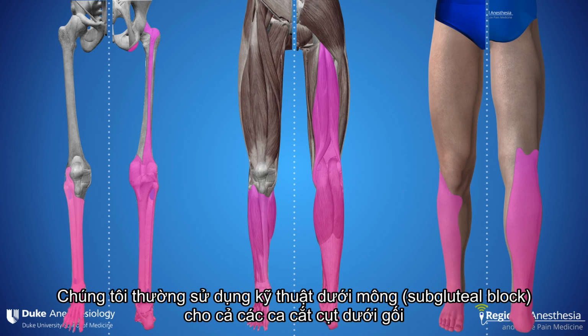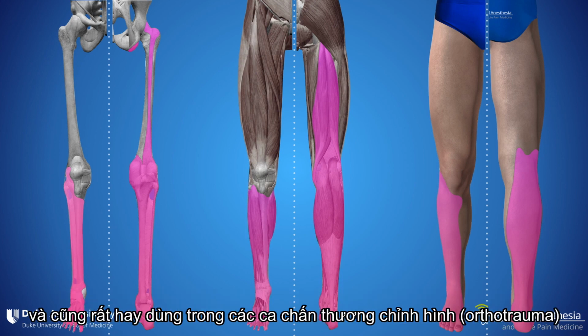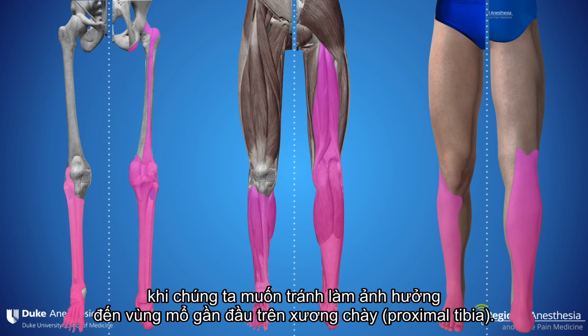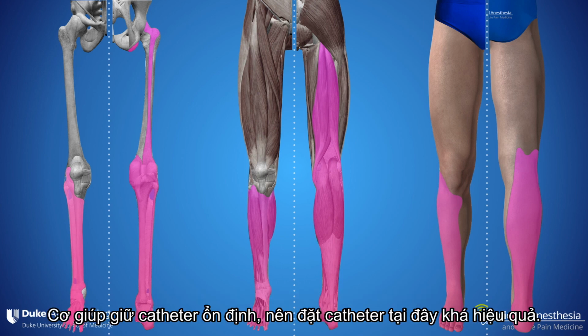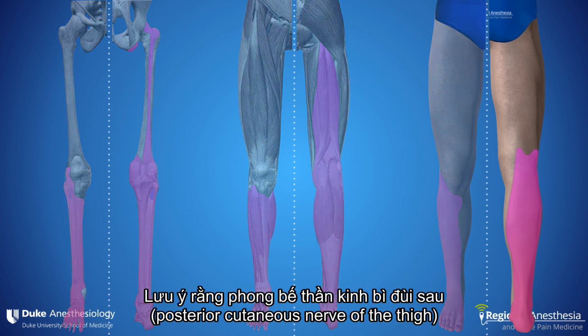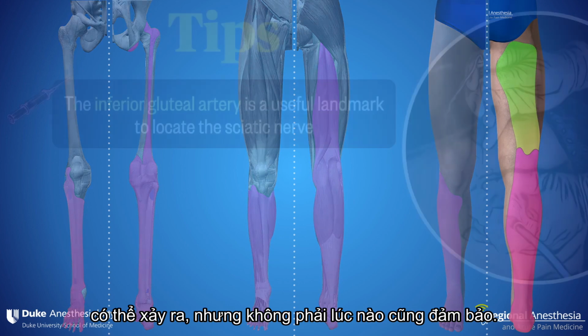We use the subgluteal commonly for both below and above knee amputations, in combination with a femoral block for ACL repair, and frequently for orthotrauma cases where we want to stay out of the way of the surgical site near the proximal tibia. Catheters work well here too, as a muscle tends to hold them in place. Note that a block of the posterior cutaneous nerve of the thigh can occur, but it's not guaranteed.